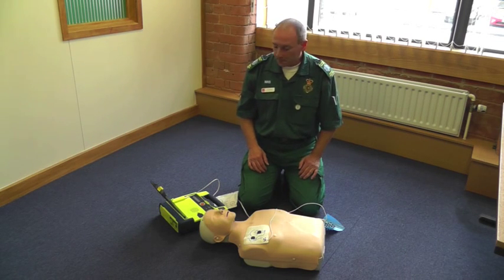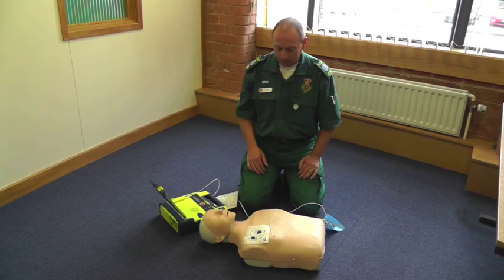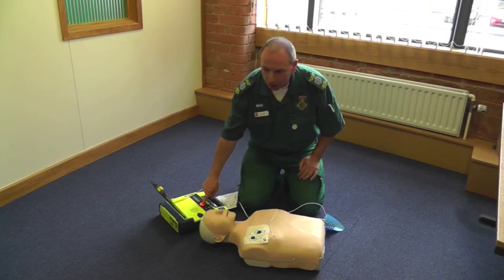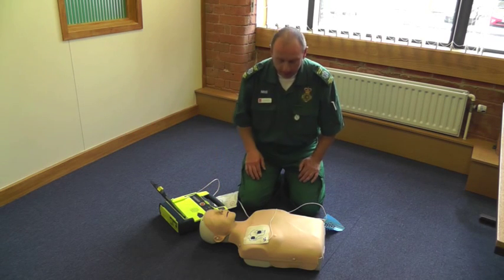Do not touch patient, analyzing rhythm. Shock advised. Charging. Stand clear. Push flashing button to deliver shock. Stand clear. Shock in. Stand clear. Shock delivered.